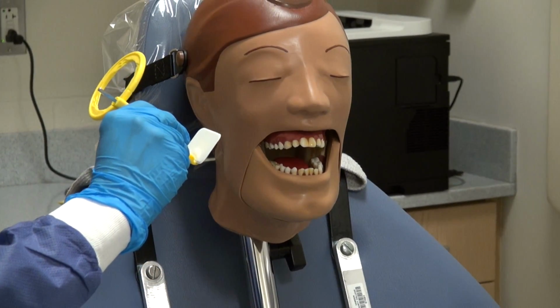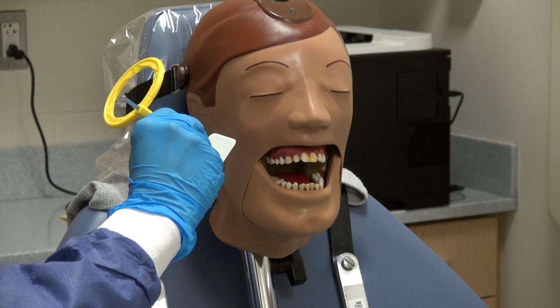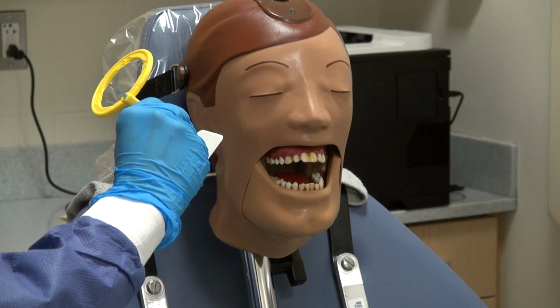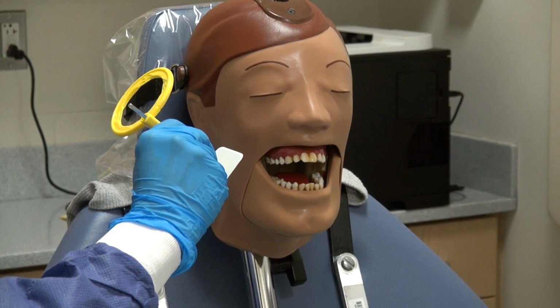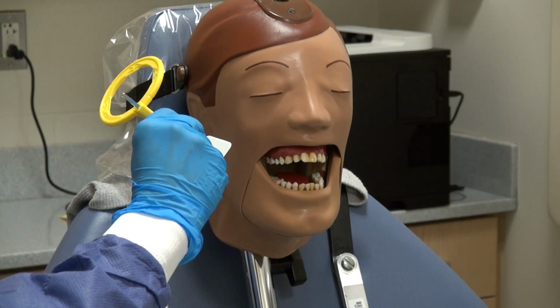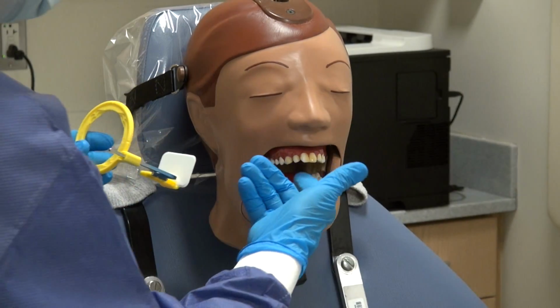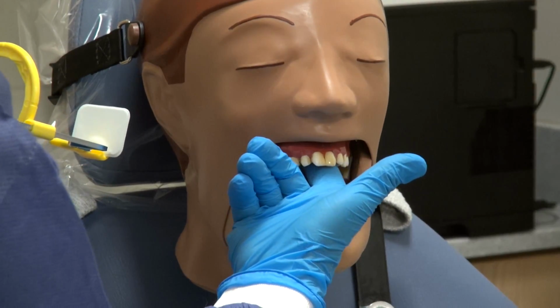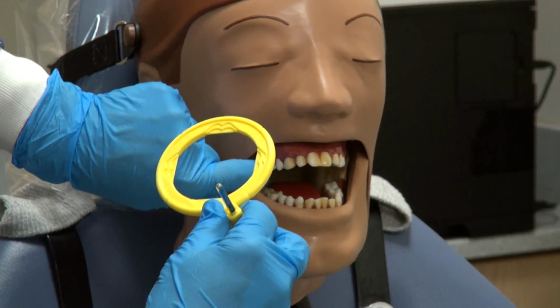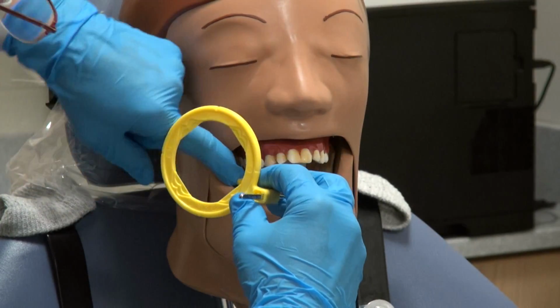We have to consider that this posterior image may cause the patient to gag, which is why we start in the front. You are trying to build a rapport with the patient and make them feel comfortable so that by the time you get to this image, by the soft palate, which could trigger the gag reflex, they may be more relaxed. Assess if there is a maxillary torus that you may have to get behind or in front of. We're going to retract the cheek, go in flat, and try not to touch the palate until you are ready to have the patient close.